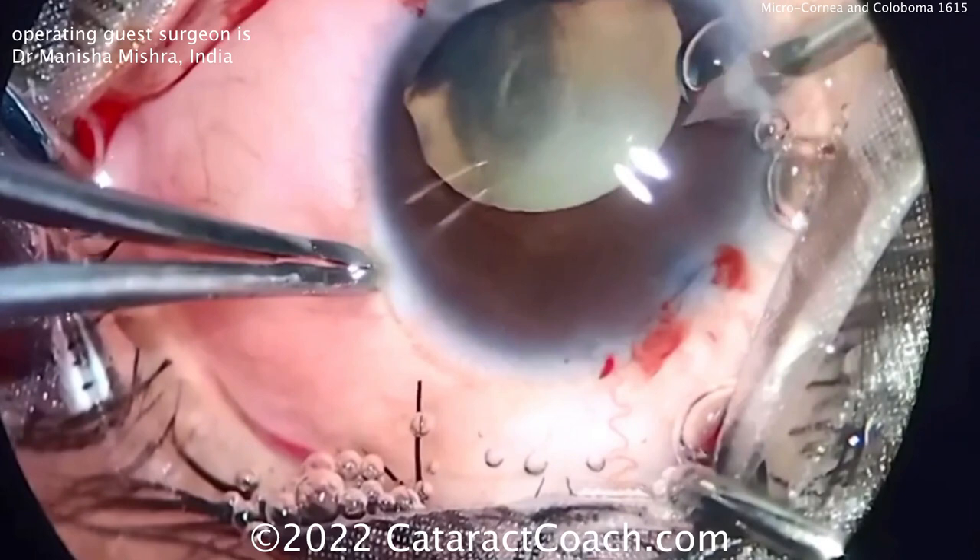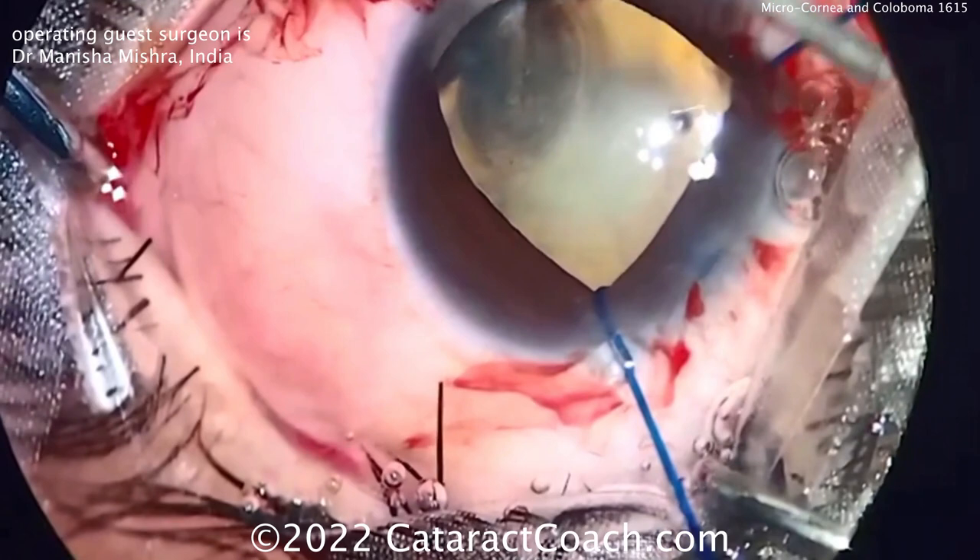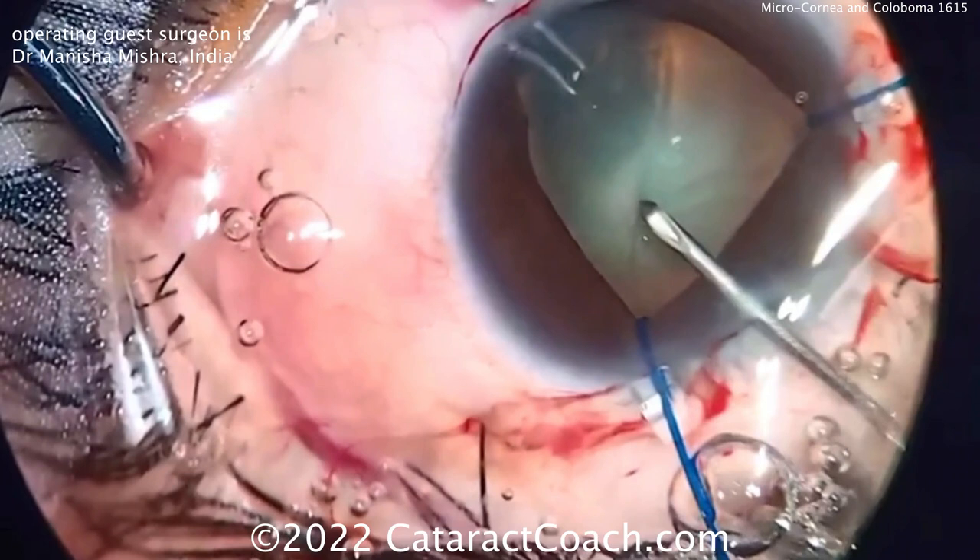Remember where the coloboma is — there's also a lack of zonular support, and you have a communication there. So you can inadvertently put blue dye in and have it go into the vitreous cavity, and you'll lose your red reflex. Now the iris hook is going in to expand that pupil and give more working room.